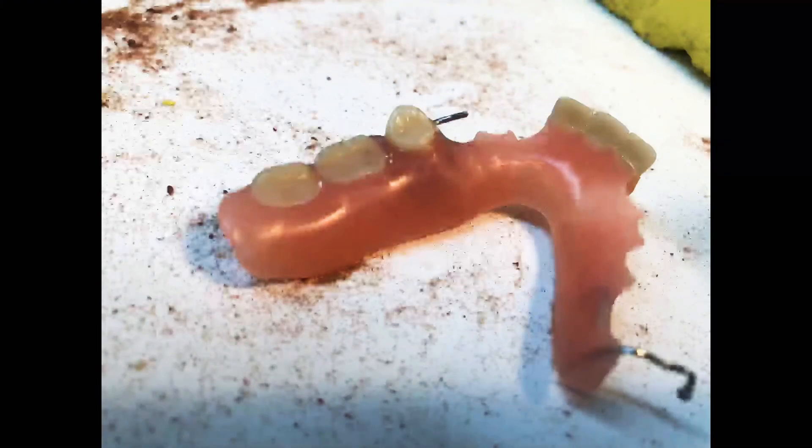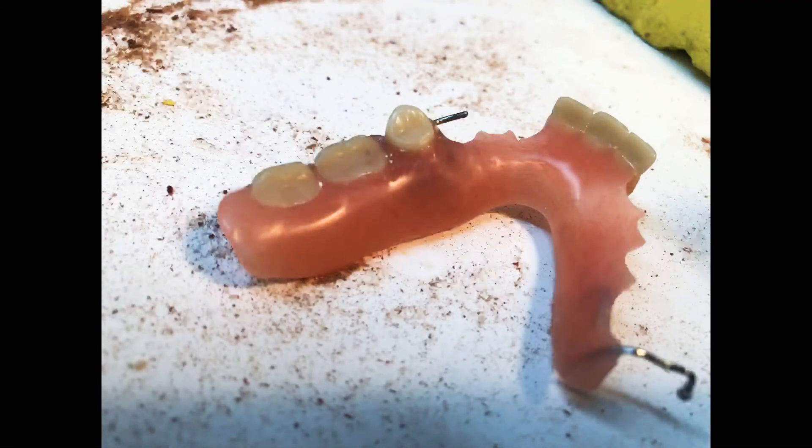Then just throw it in your disinfecting bath. By law, you're required to disinfect it before it leaves the lab — keep that in mind if you're new to this. You may have noticed the color difference. We've blended it pretty well, but the older dentures will come in with an obviously more faded color from use. We try to blend it as well as we can, but this being on the backside, it'll probably never be seen.